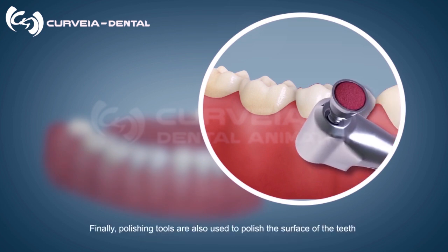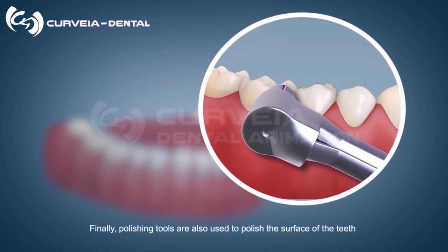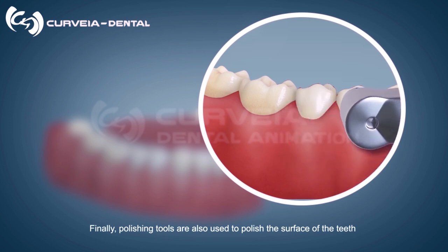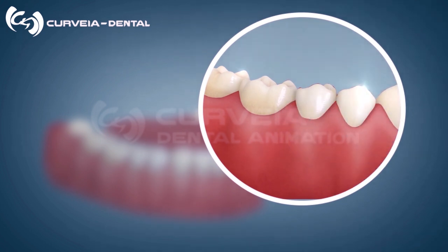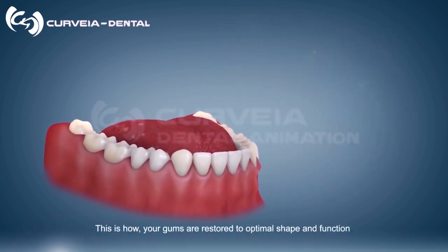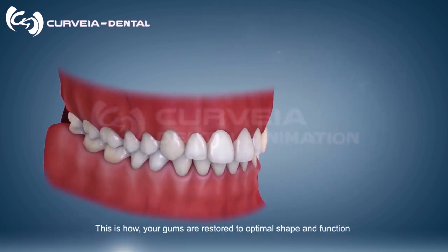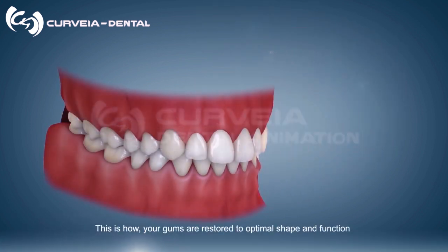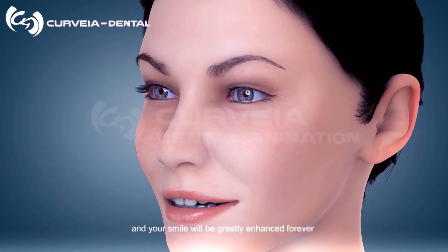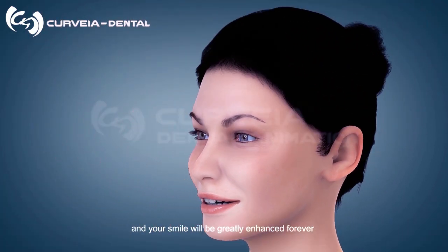Finally, polishing tools are used to polish the surface of the teeth. This is how your gums are restored to optimal shape and function, and your smile will be greatly enhanced.